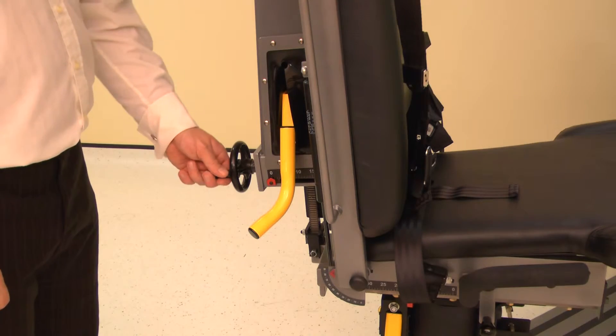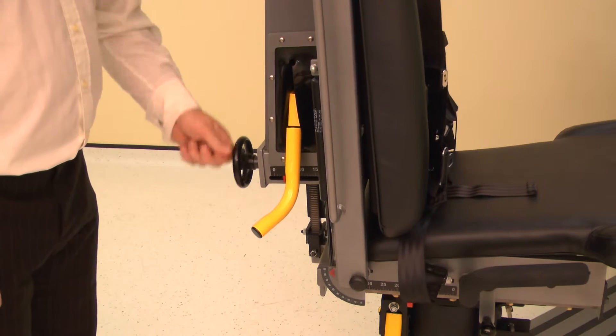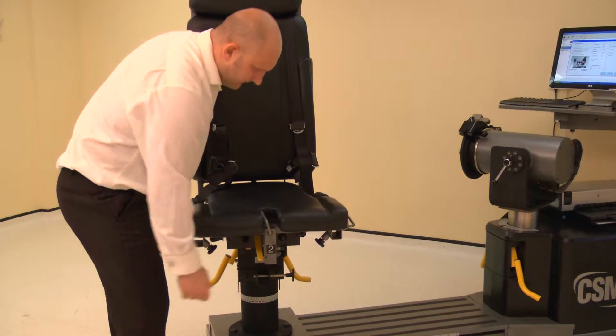Set the chair back translation by winding the handle. Adjust the chair back translation to position 0. Set the seat to the down position by lifting the seat and releasing the lock.